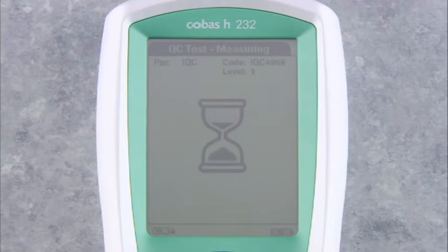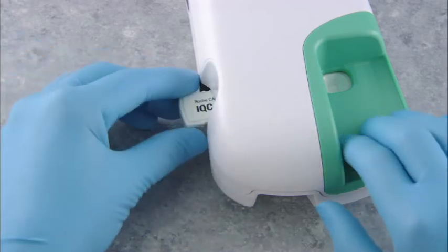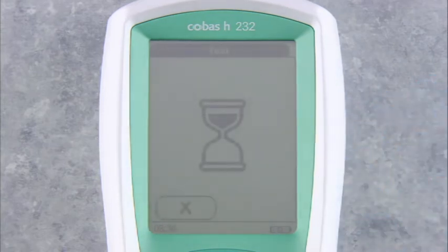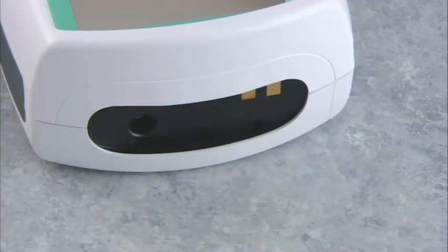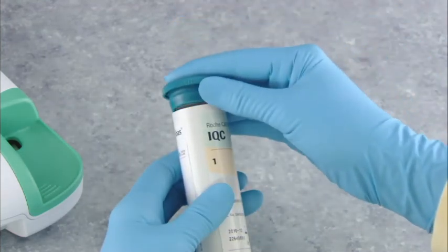In about 30 seconds, the screen changes to QC test processing. In about 30 seconds, the result appears, indicated as pass or fail. Results from the IQC test are automatically stored in the meter memory. Remove the IQC low strip — the screen returns to the main menu. You can repeat this procedure with the IQC high strip, following the same steps. After testing, remove the IQC code chip and return both the code chip and strips to the IQC container. Close the container tightly.